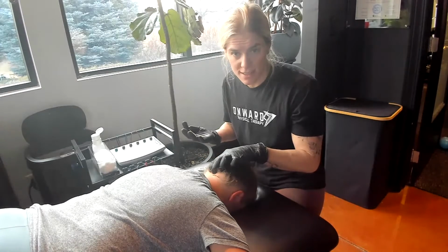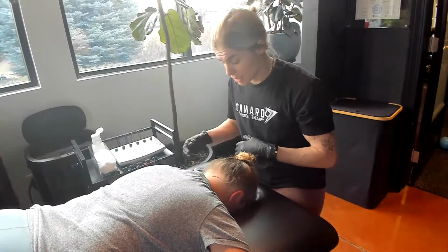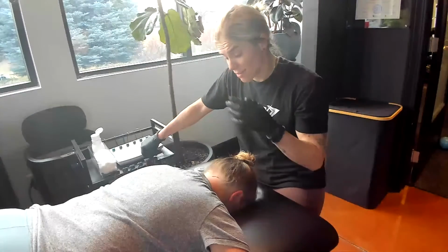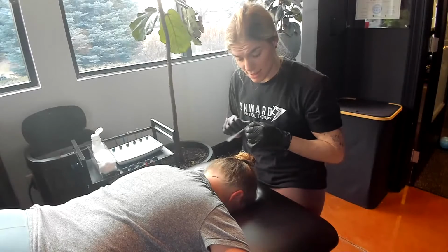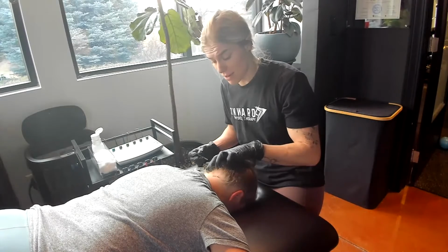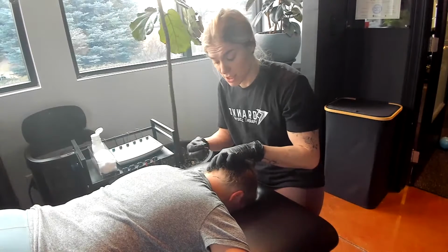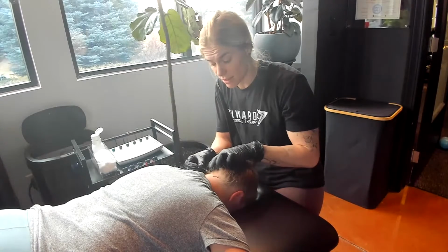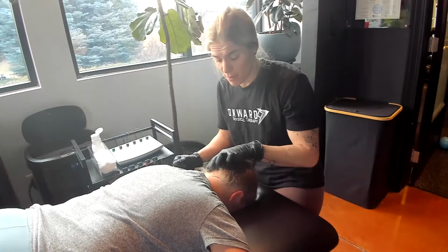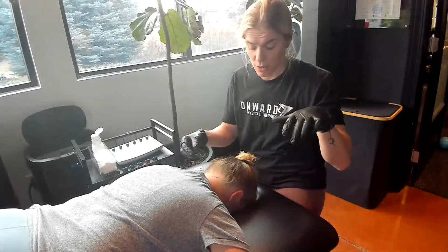Again, we're limiting the pistoning in this area because we have some sensitive structures like that greater occipital nerve, really close to the upper trap insertion there. You're then going to step just lateral to that to interact with the semispinalis insertion at the occiput. So again, 1 finger breadth lateral to that, avoiding that sulcus between the mastoid process and this muscle tissue, compressing tissue. Now my needle angle is a little bit more towards the contralateral eyeball. And we're, again, looking for a bony backdrop here, maintaining that depth as we let that tissue recoil.